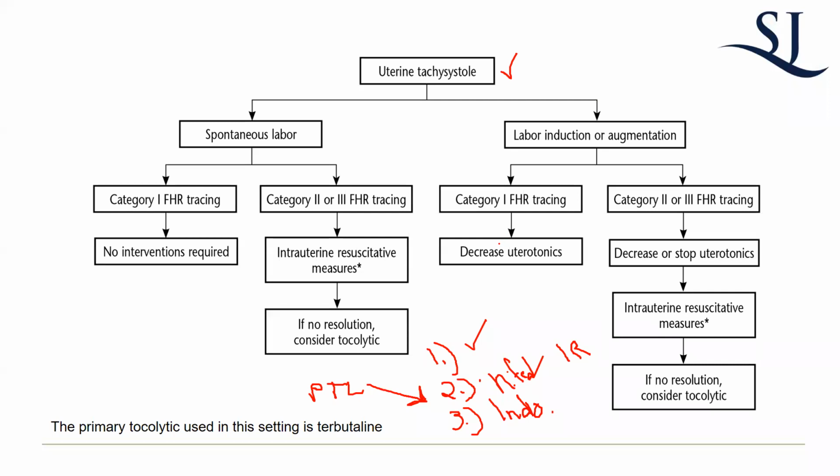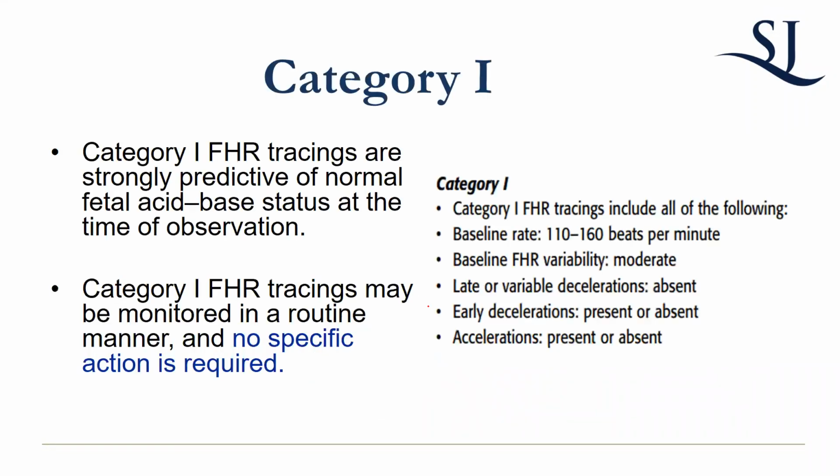Okay, any questions on that? Because that seems to be kind of confusing. It's really just that. So just get that straight in your head, okay? So putting it all together, category 1 is reassuring. There's no specific interventions that you need to do. You're good. Continue present management.